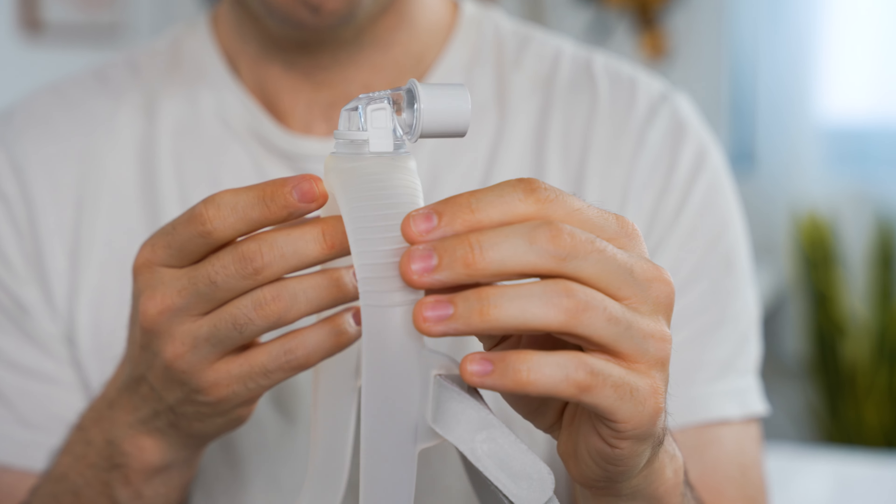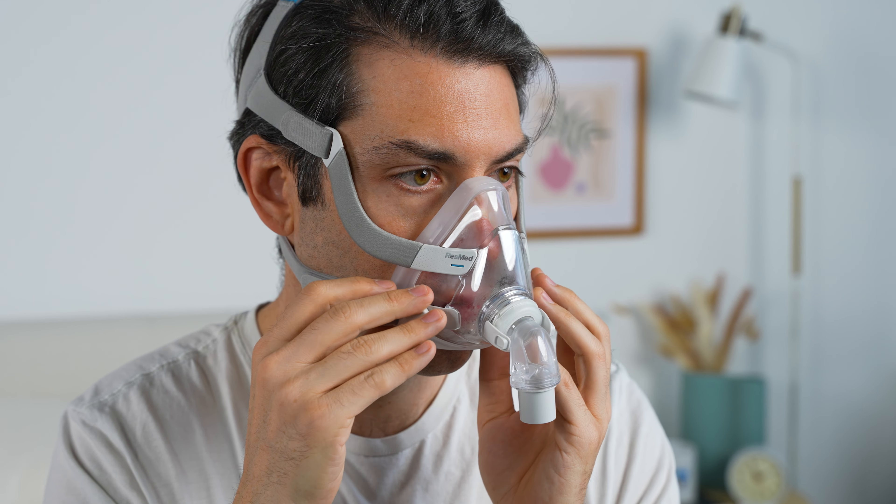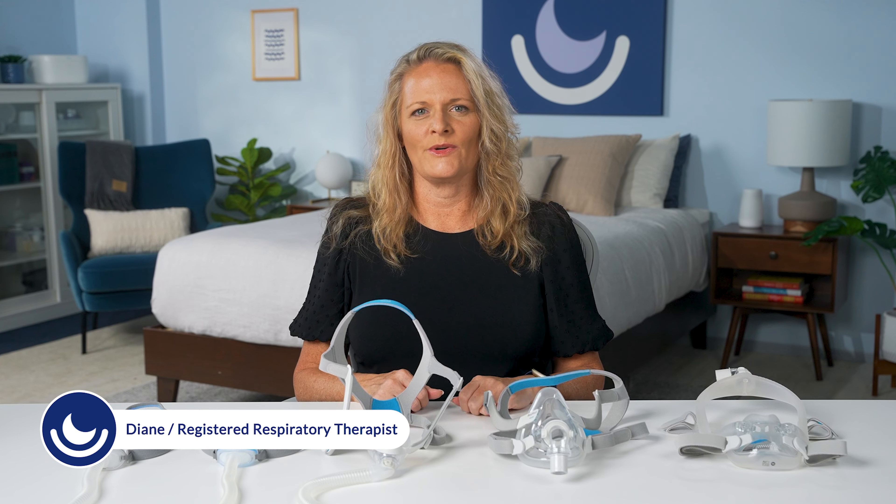There are a ton of different CPAP mask options out there, but how do you know which one is right for you? In this video, I'm going to walk you through every mask style, how to fit each mask properly, and how to choose the right mask for you based on your sleep apnea symptoms and personal preferences.